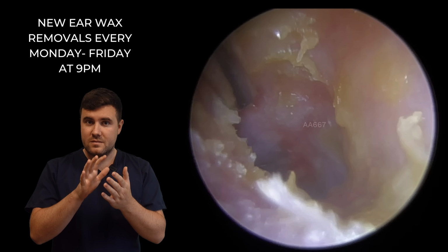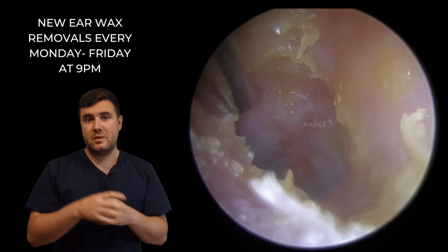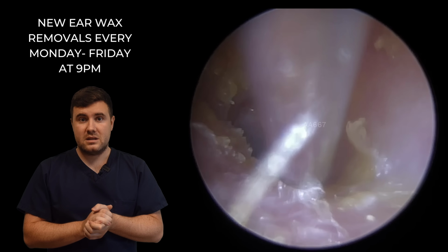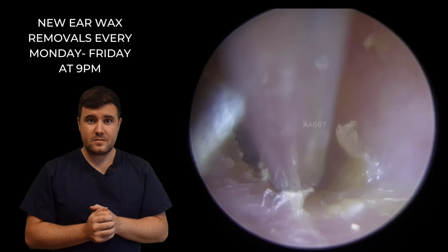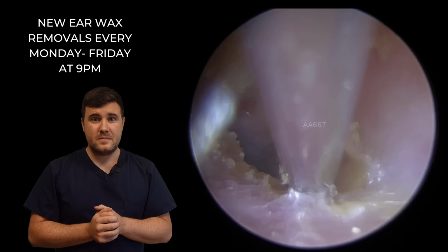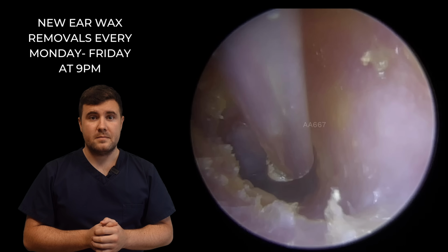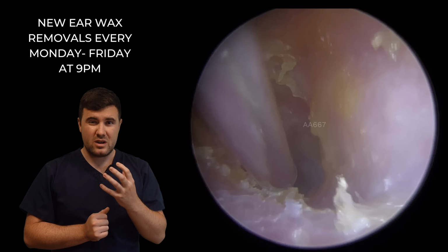So because this is very deep in the ear canal, we need to avoid touching up against the actual canal itself. It's very uncomfortable and sensitive, this area. So I'm just trying my best to clean as much of this as we possibly can. And you can see it's just coming away in little tiny pieces. There we go. There we go. Little bits at a time. Again, we're not rushing in these little bits. You know, we've got to take our time.